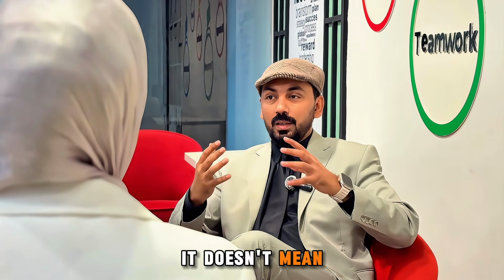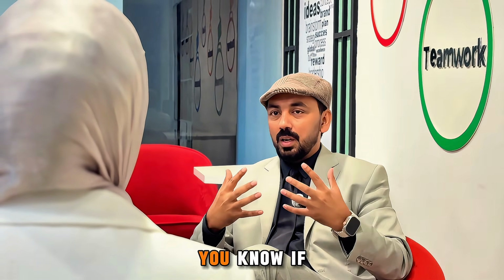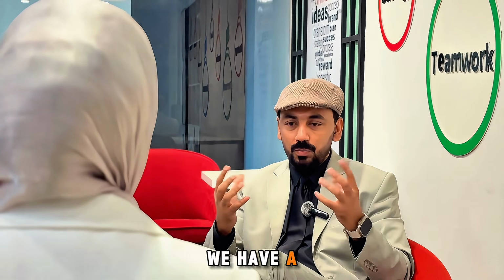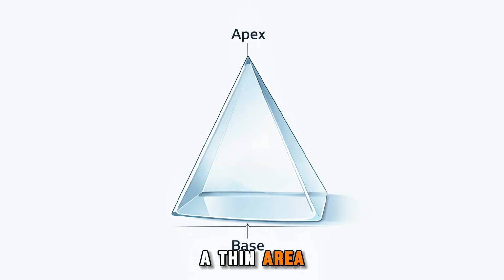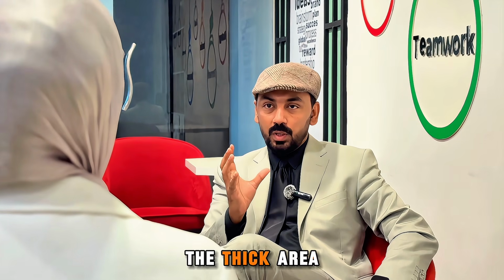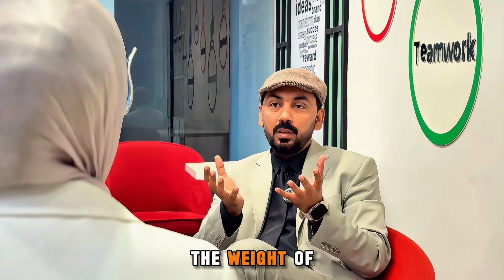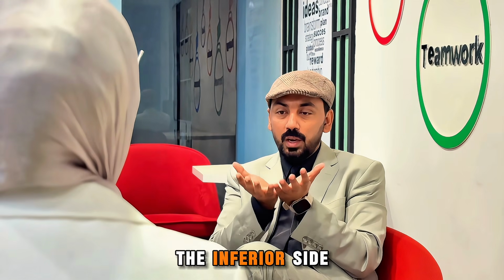Number one is called the prism ballast, right? It doesn't mean that we have prism in the soft toric contact lenses. No, prism ballast means the technique is prism ballast. If we talk about a prism, we have a thick area which is called the base, and a thin area which is called the apex, right? So this prism ballast technique is applied in such a way that the thick area, the 6 o'clock position, the inferior side of the contact lens, behaves like a base.